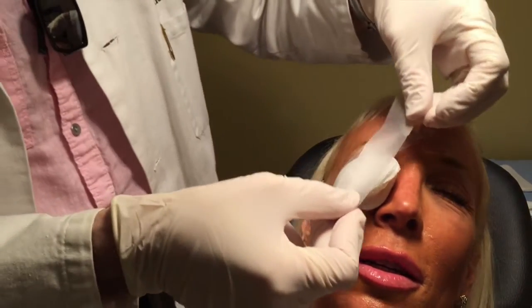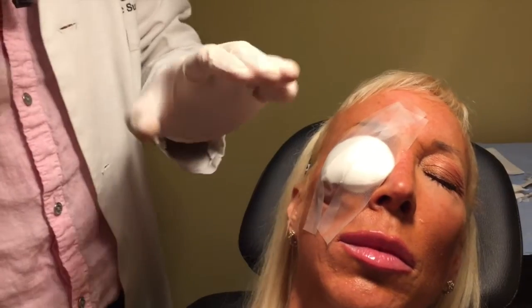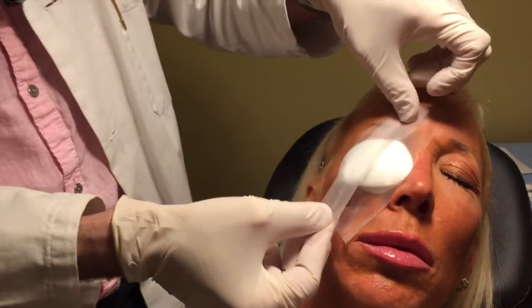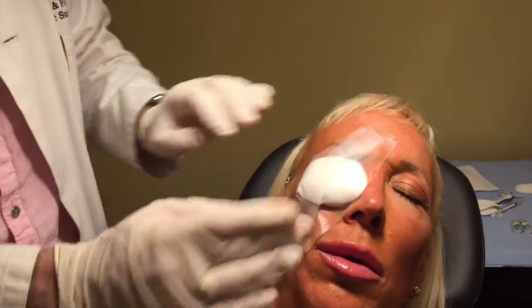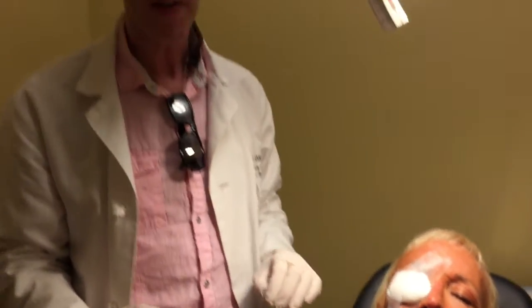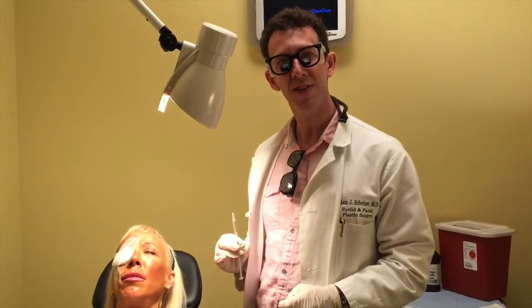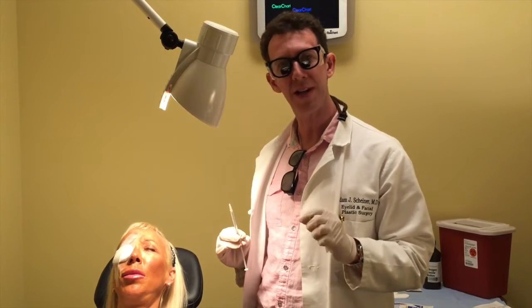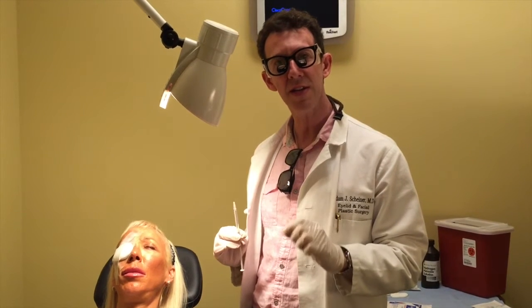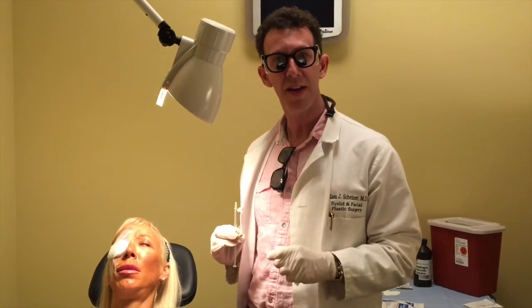And here we are putting on both laterally and medially. I then will usually do one more right down the center to put under just greater tension. We're trying to push the hyaluronidase into the tissue with the application of these eye pads. We've injected the first side, and that is now under occlusion. We're now about to inject the second side, and likewise put it under occlusion. And what the occlusion does with the eye pads actually drives the hyaluronidase into the tissue where the hyaluronic acid is in an effort to dissolve that hyaluronic acid.